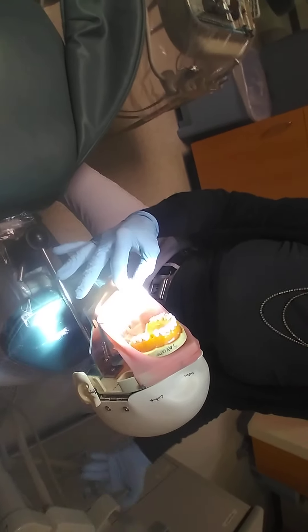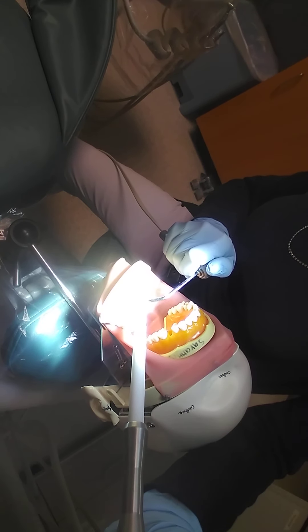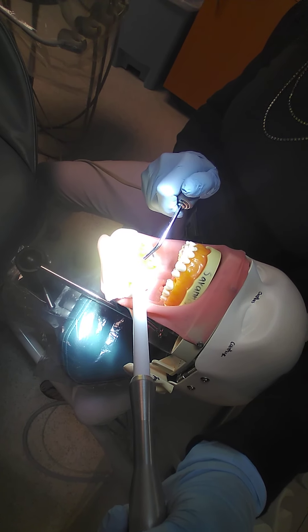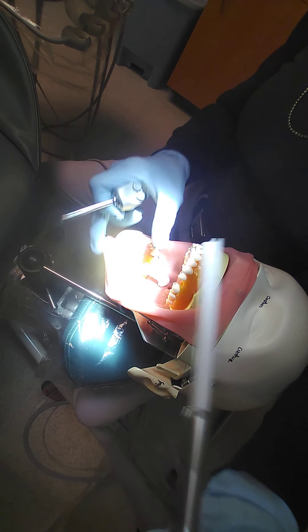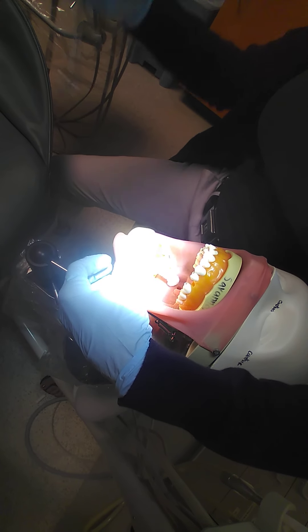I'm going to have the patient stay open and do a limited rinse. I'm going to hover over and suck up this material, then do a limited rinse starting with a little stream of water, make a slurry, and rinse that for 5 to 10 seconds. Then I'm going to air dry — I'm only going to thoroughly dry the enamel.